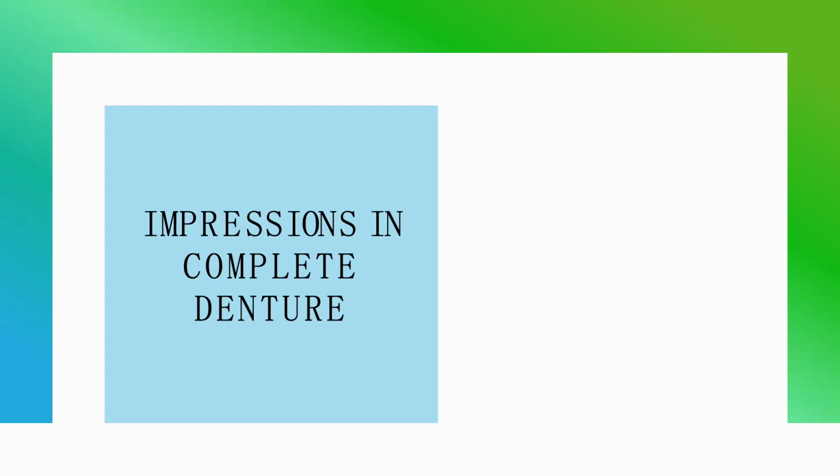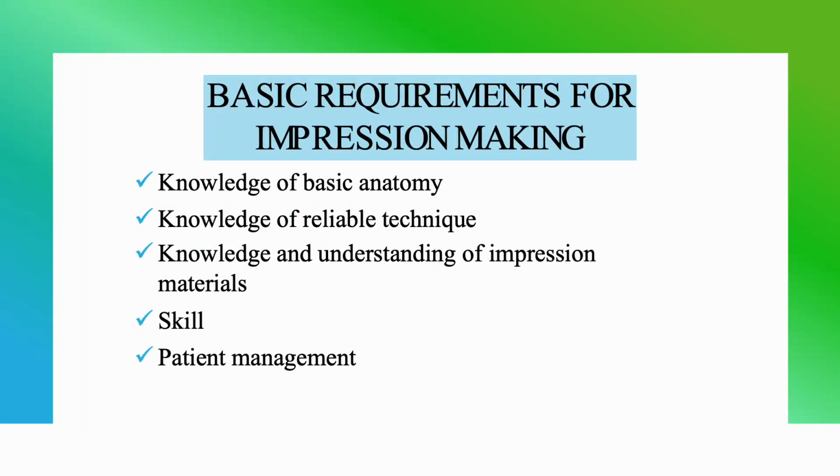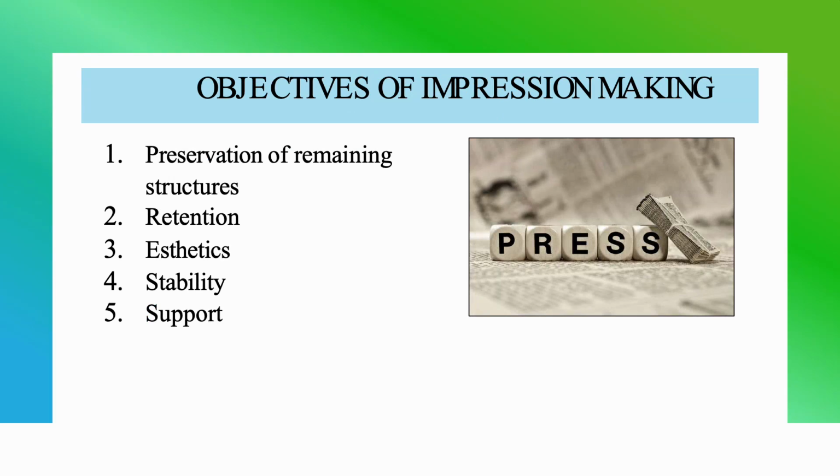Impressions in complete denture. Basic requirements for impression making are knowledge of basic anatomy, knowledge of reliable technique, knowledge and understanding of impression materials, skill and patient management. The objectives of impression making are preservation of remaining structures, retention, aesthetics, stability and support.